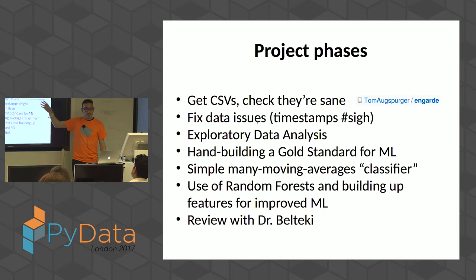So we had to get CSV files out of Gusztav. These are files, they're a million rows plus. So they're bigger than will fit into Excel, so they're not easy to deal with from a non-programmer's point of view. But if you can put them into Python, then with pandas, you can start to look into the data and start to do some plots, of course.